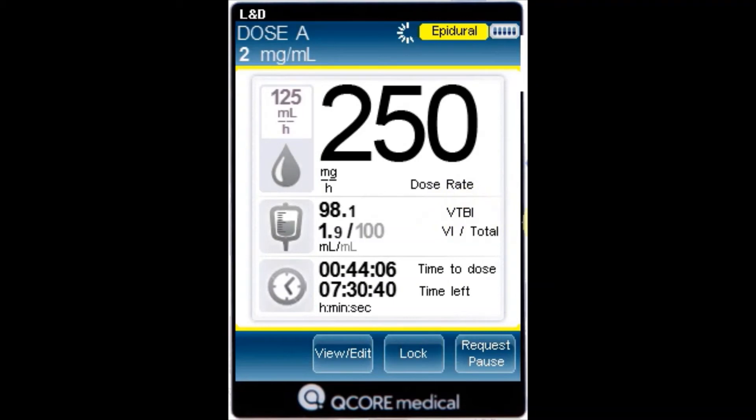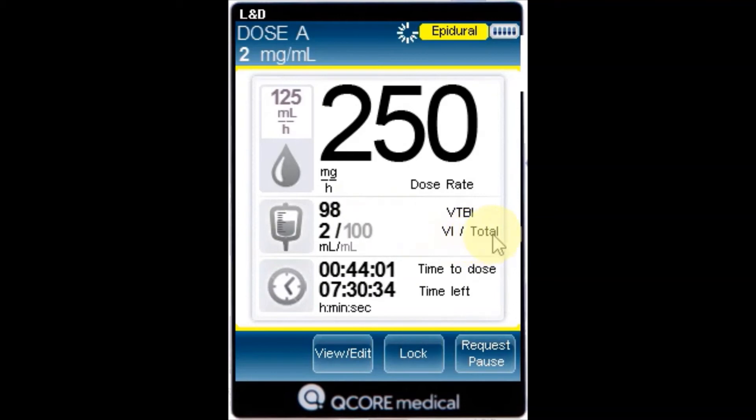VTBI: the total volume left to be infused. As the infusion progresses, this value decreases.